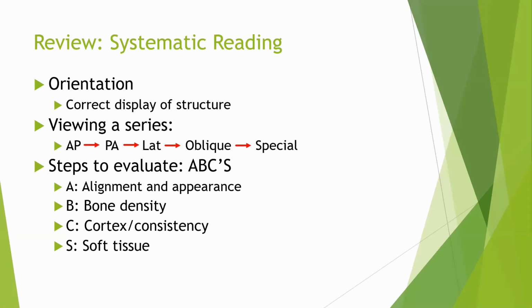Then steps to evaluate. This is not the end-all, be-all. There are many different types of evaluative measures, but to me, this is very basic, simplified, and easy to go through. I still do it this way because it's simple, and it completely serves the purpose in terms of clinical practice and research.